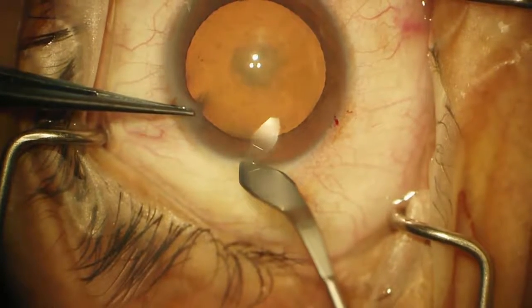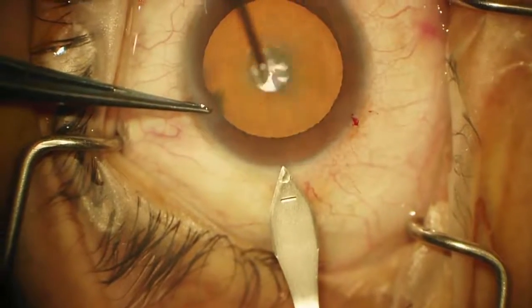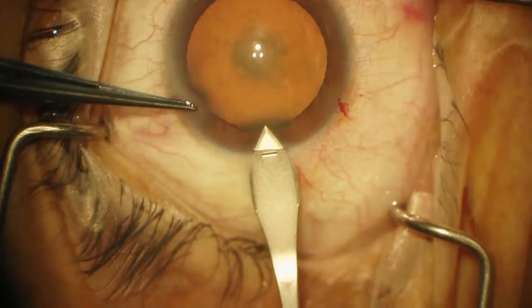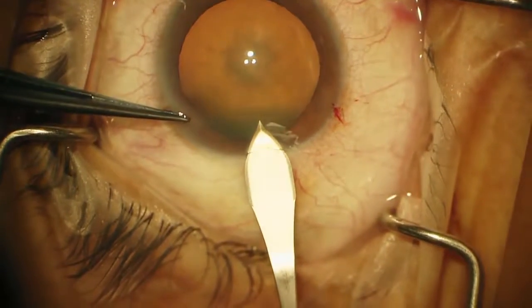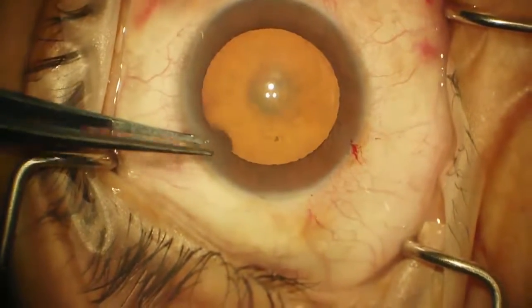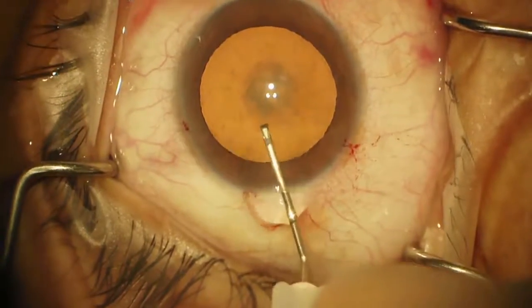I like to make a little groove rather than going straight in. Many people like to just go straight in with the keratome, but I feel like it gives me something to aim at — it's about just a third of the thickness. Now I will bend the needle for my capsulorhexis.